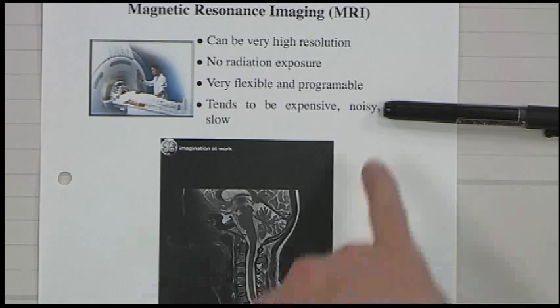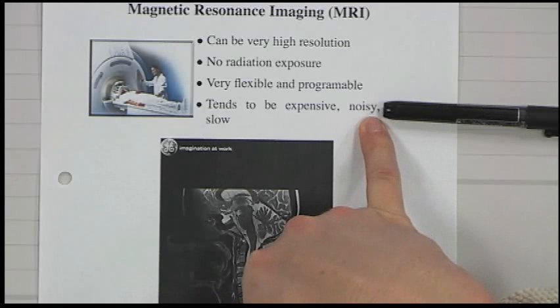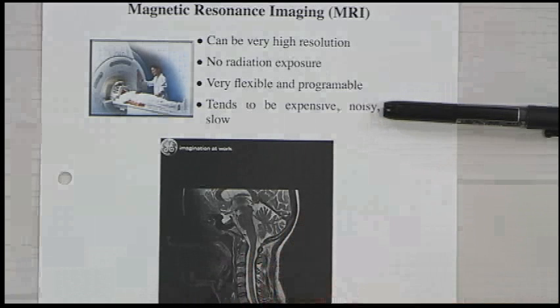And it's actually noisy in an acoustic sense. It's like a gigantic speaker. When you have these gradients, it's like you're putting an input to a gigantic Bose speaker, and it makes a lot of noise. That can be uncomfortable for the patient. They can wear protective headphones to protect their hearing.